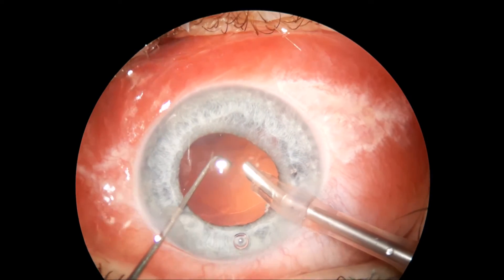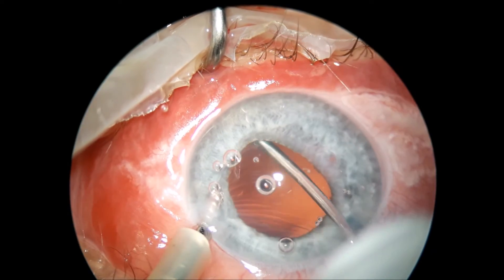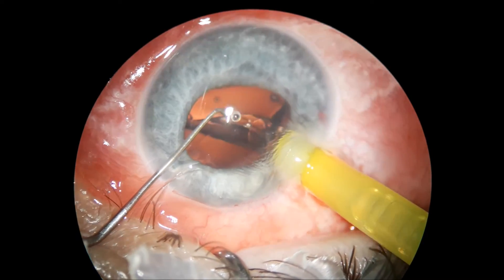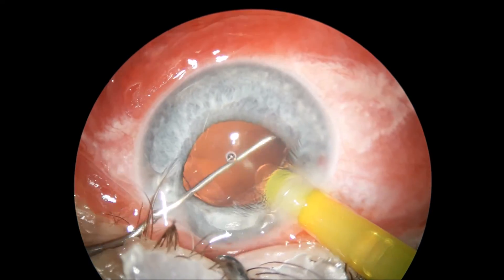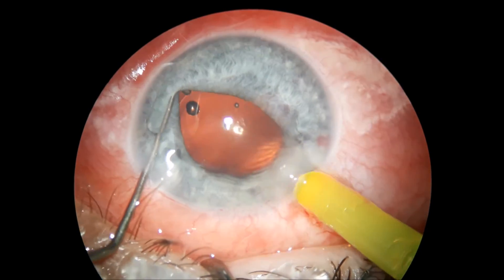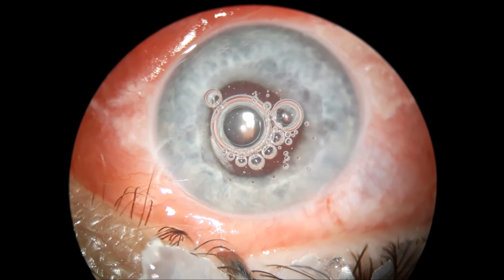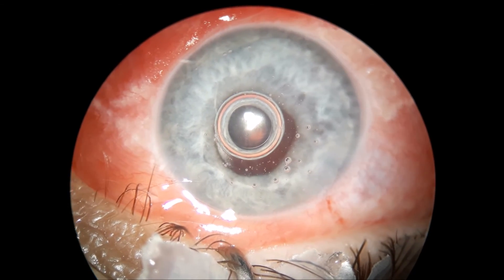I will place an AC maintainer and get the remnants of that cortex out of the eye, then inject the IOL into the viscoelastic-filled bag and dial the IOL into the right place. At the end I will place some miochol to constrict the pupil a little bit, and I am using a tip to hydrate the cornea incision back into place.